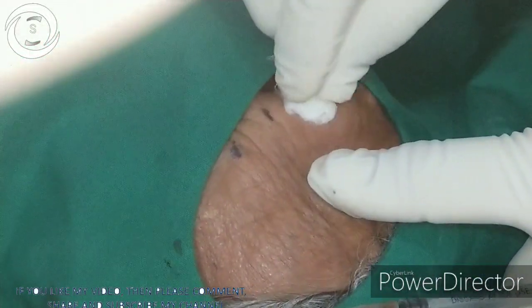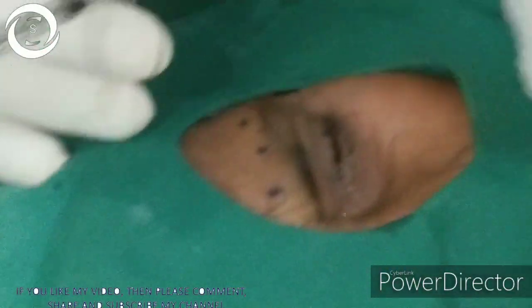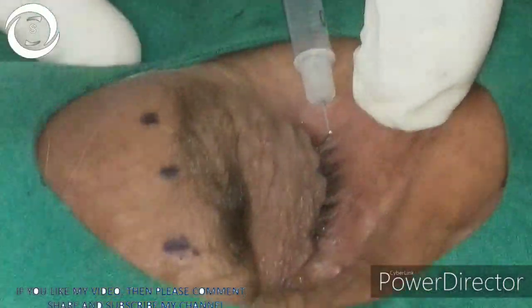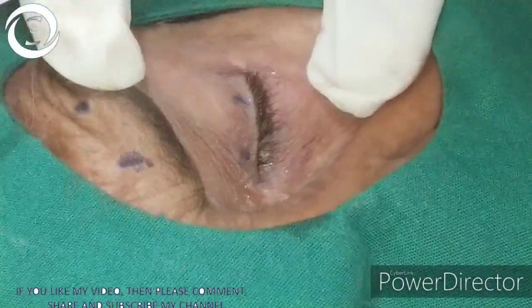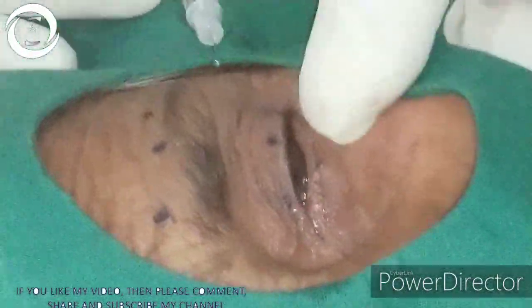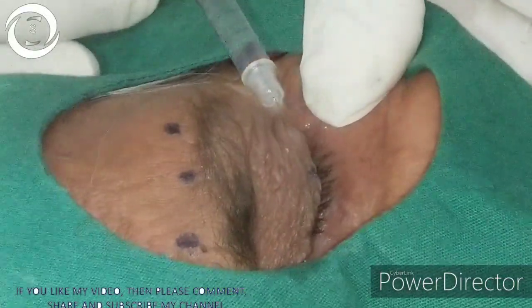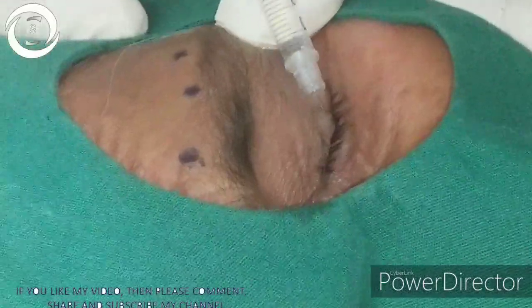How many units per injection site depends on the severity of blepharospasm and how many previous injections have been given, because with each additional injection you may need to give more units per site. For the procerus, five units; for the medial brow, five units — in these areas the skin is thicker so injections are also deeper. In the pretarsal area, two to three units, just beneath the skin. Botox takes one to two weeks to take effect, with maximum effect after two weeks to two months, then gradually wanes off. Post-op paracetamol for pain and artificial tears for dry eyes are given.